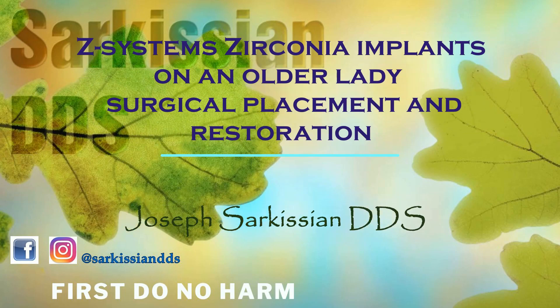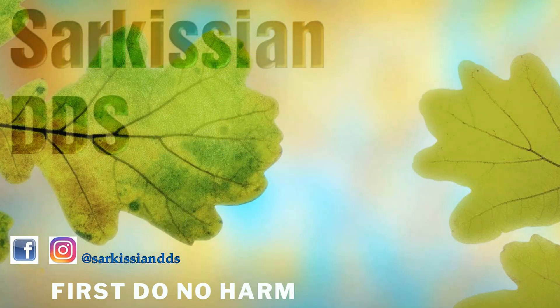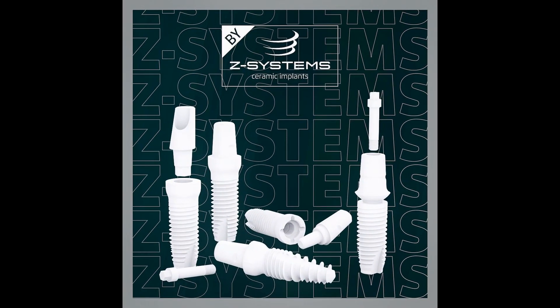The best gift you can give an elderly lady is to get them out of their dentures. Hi, this is Dr. Sarcusian. In this video I will be showcasing the restoration of the lower jaw with four implants — sufficient to do precisely that: throw away the lower partial denture.